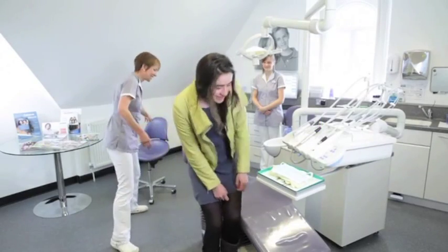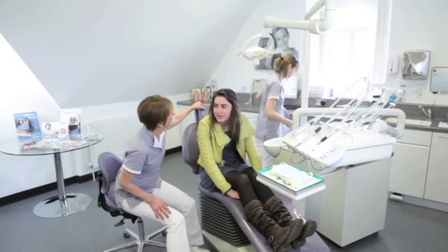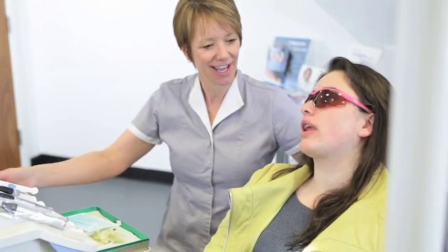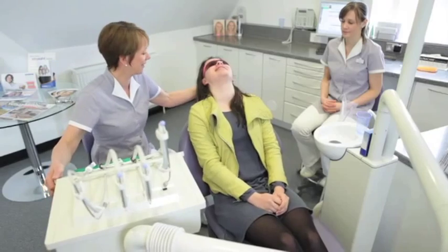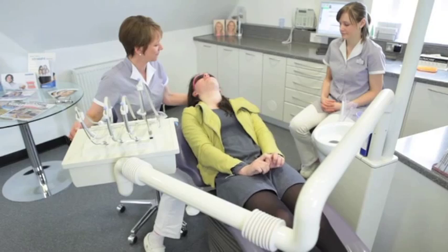When it's time for your braces to be removed, you come in for what we call a debond appointment. That means we're going to take your braces off your teeth, polish your teeth up so they look lovely and shiny, and fit you with some retainers to stop your teeth moving again.